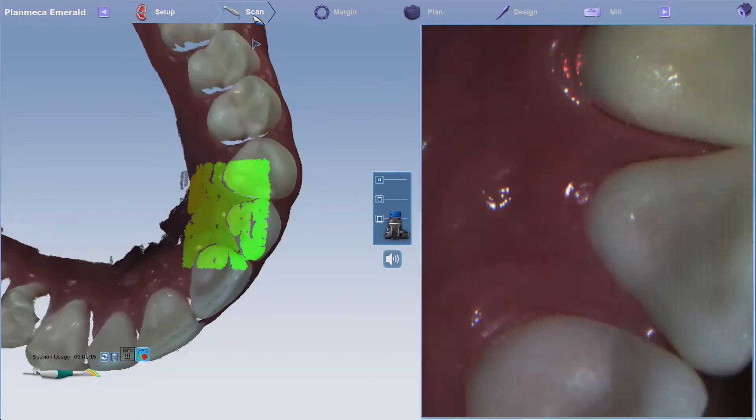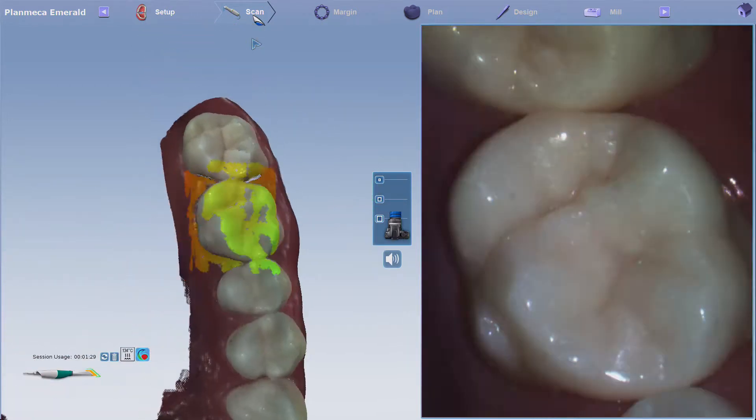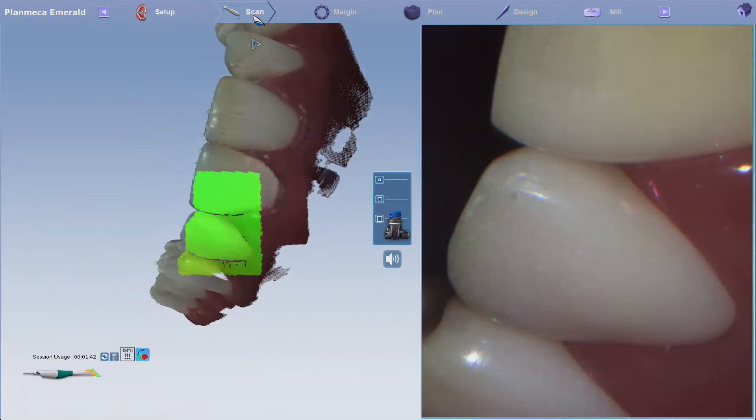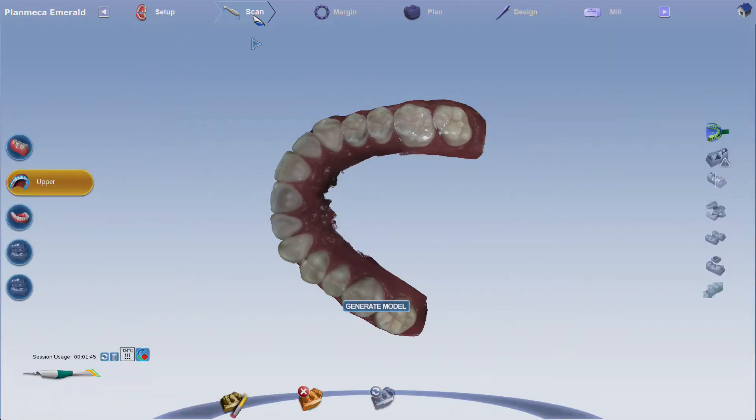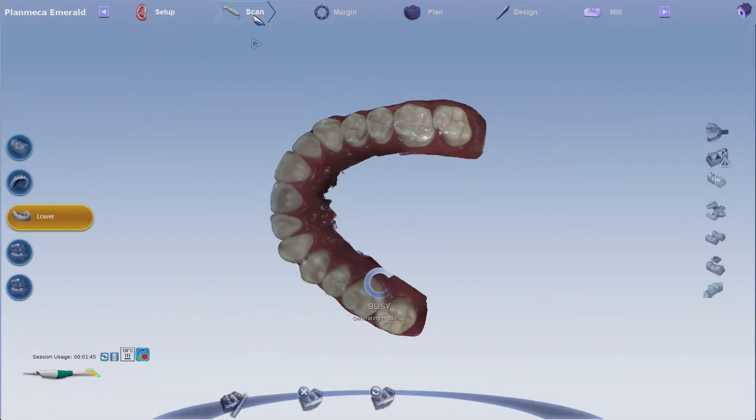Fill in where needed. Move to the next scan by pushing the bottom button of the scanner.